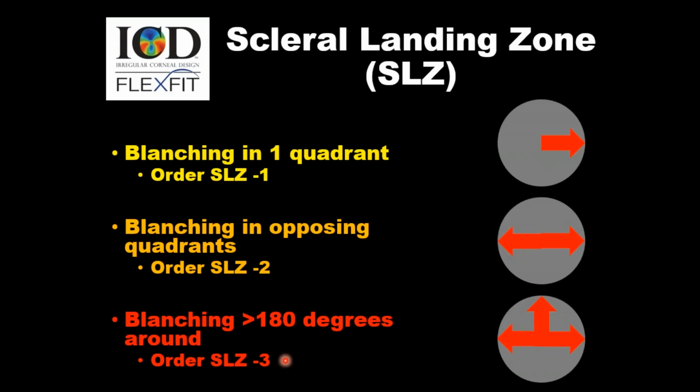Now, if this is confusing, talk to the consultant. They can be very helpful with these calculations. Tell them you have severe blanching and you need to increase the edge lift, but you don't want to lose the sagittal depth that you presently have. Maybe it's perfect. So they will compensate with either a change to the peripheral corneal clearance zone or the base curve, or if you have inappropriate limbal clearance, they might alter that instead.